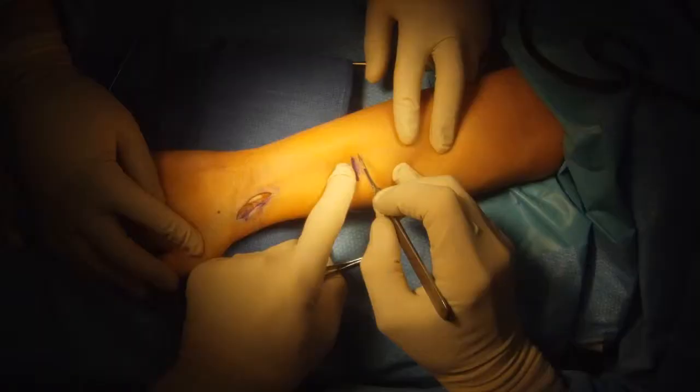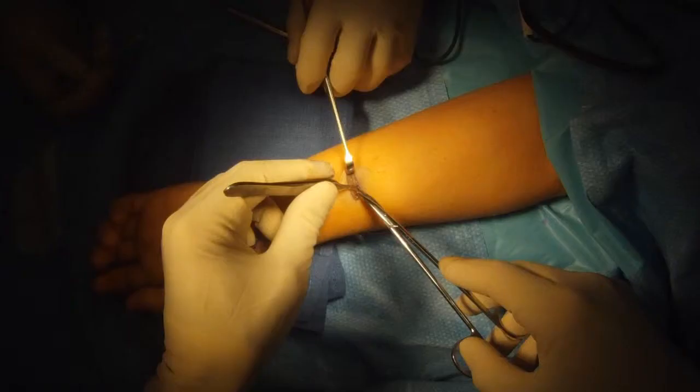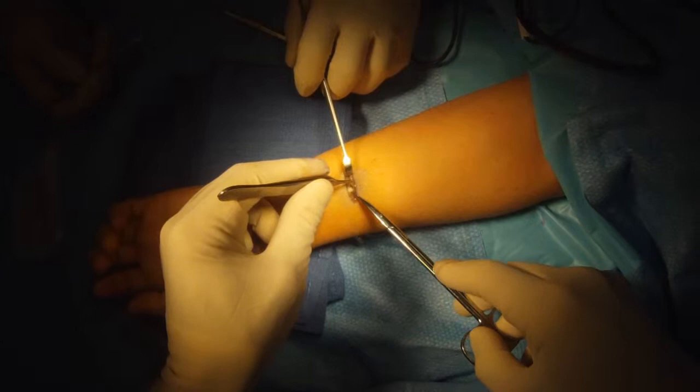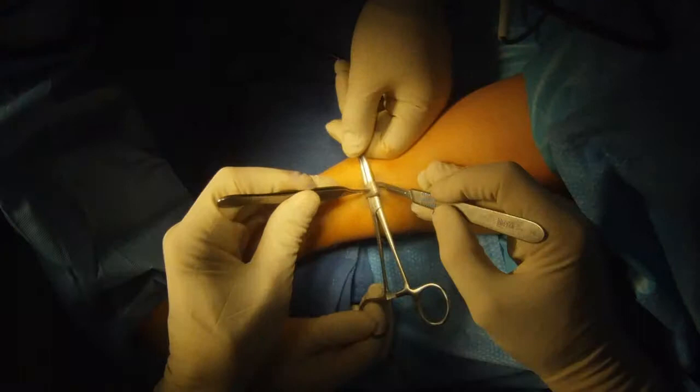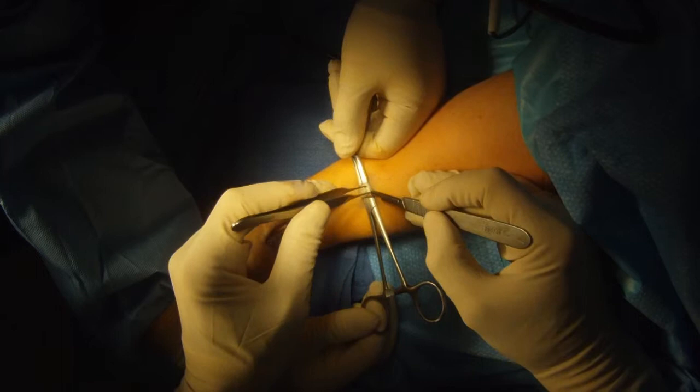I'm going to over-drill it with a drill to make a tunnel to pass the tendon graft through. Now we'll harvest the tendon graft. I'm going to isolate the tendon on the palmar surface of the forearm and take a third of this tendon. That doesn't cause any problems — the remaining two thirds is plenty strong enough.